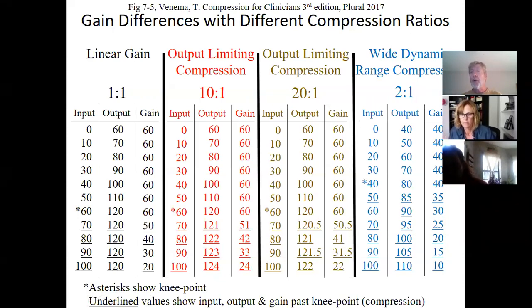Well, for her, our focus isn't even going to be on limiting the MPO. Our focus is going to be on lifting the floor. Not limiting the ceiling, lifting the floor. Because we're trying to imitate outer hair cells here, because she's got outer hair cell damage. Mild sensory hearing loss. So what's going to be the degree of her hearing loss? Mild to moderate. Because what do the outer hair cells do? Help the inner hair cells pick up sounds below 50 dB.